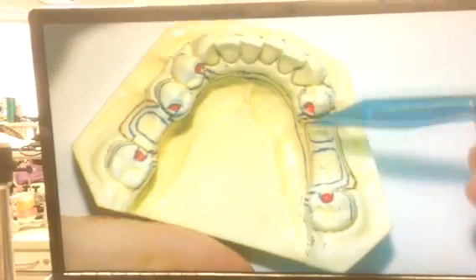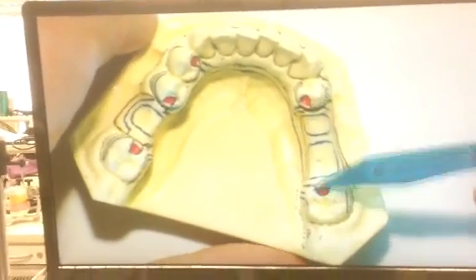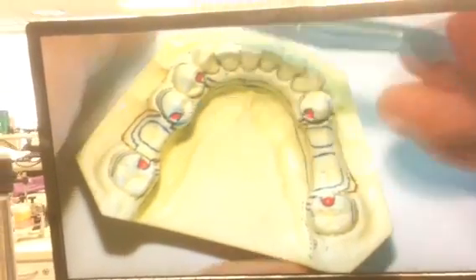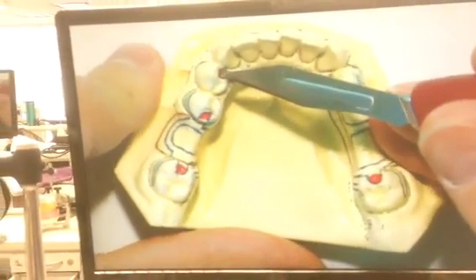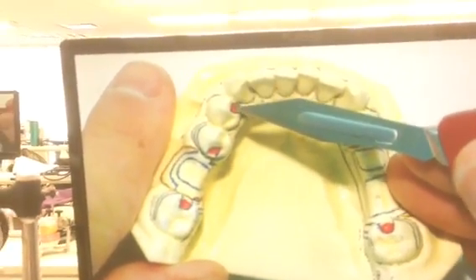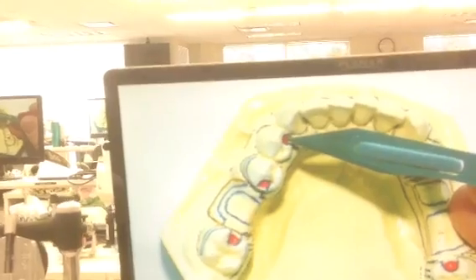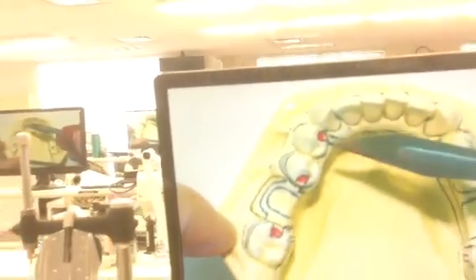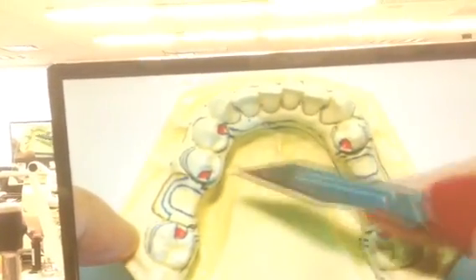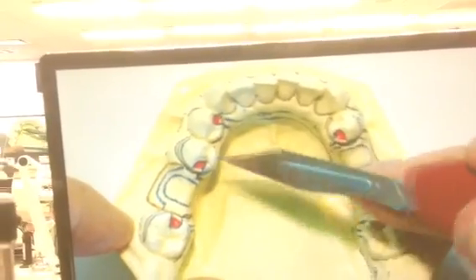Because this is tooth bound, class 3, we can have distal rests, so we can have a rest on each side of the space, which is what I like. They placed an indirect retainer here, you wouldn't have had to have it. But I like it, I would do it. But because there's no fulcrum line, we don't technically have to have that indirect retainer. But we need a rest on each side of the space, and we need the 4 clasping systems.